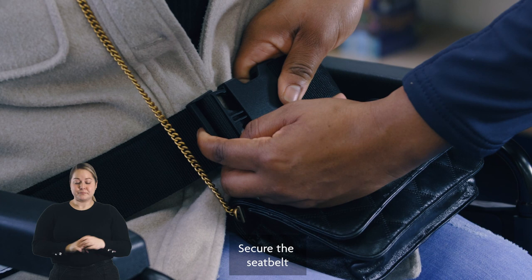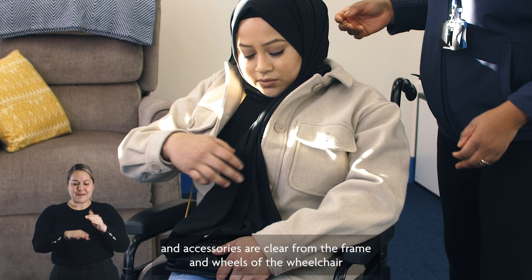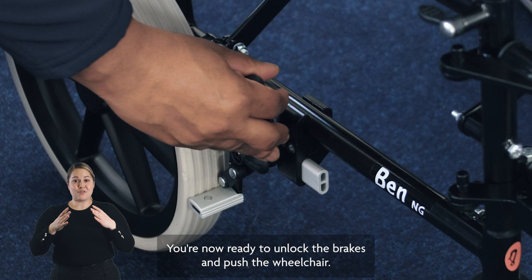They can then lower themselves into the chair, making sure that when they are seated their lower back is in contact with the back of the seat. Secure the seat belt around the wheelchair user's waist and guide their feet onto the foot plates. Make sure that elbows are in and be mindful that all clothing and accessories are clear from the frame and wheels of the wheelchair.